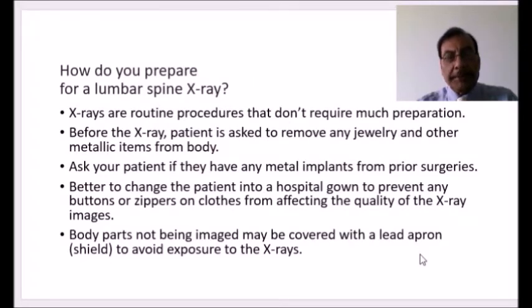And what is the preparation to be done for the lumbar spine X-ray? The X-rays are usually a routine procedure and not much is required. But there are certain things that should be done routinely. The patient is asked to remove any jewelry or metallic items from the body. You must ask the patient whether the patient has undergone any surgery where metal implants have been inserted, and it is a useful exercise.